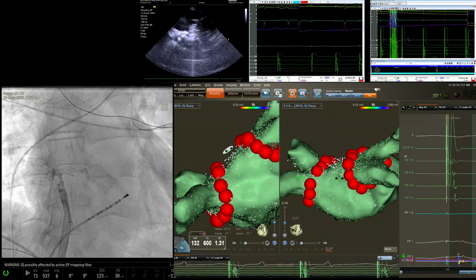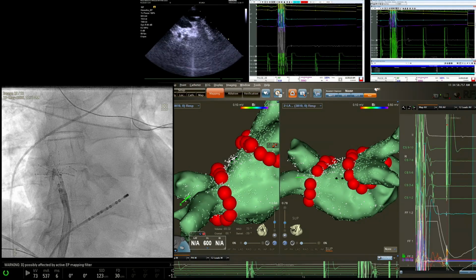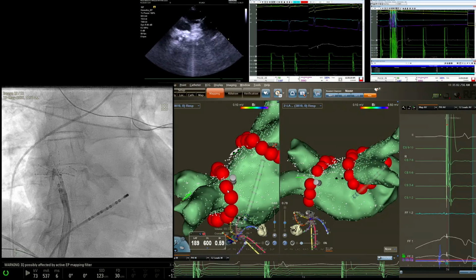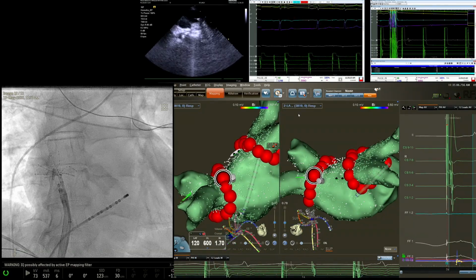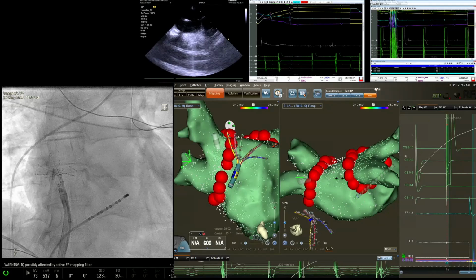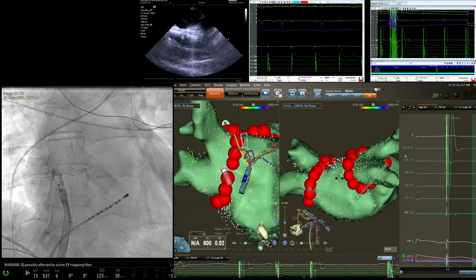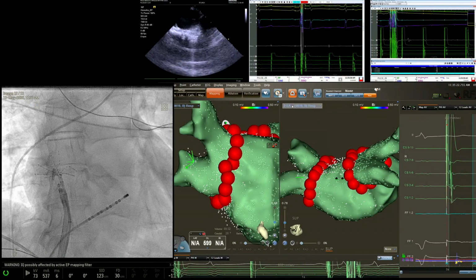Right now, what we can trust is the fact that we actually have contact or no contact. Eventually, it is going to give us more information. Point, hide, ablation. Show me RAO one more time, Chief. There's one location. I don't know if it was real or not, but I just want to put one more lesion here. Okay, point, hide, ablation. Very quick.